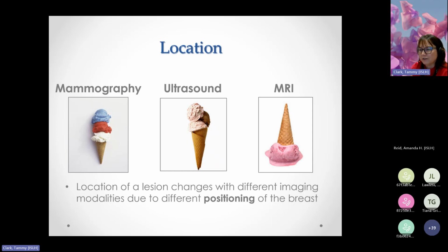sonographers. We do need to use a sponge to rotate these ladies at least 30 to 40 degrees over onto their hips so we can get the nipple pointing straight up to the ceiling, so we can image. Now, quite often, if we're going for a medial lesion, we're going to want to lie the patient a little bit flatter, so the medial part of the breast is flatter. If we're going for a lateral lesion, we might need to over-rotate them.